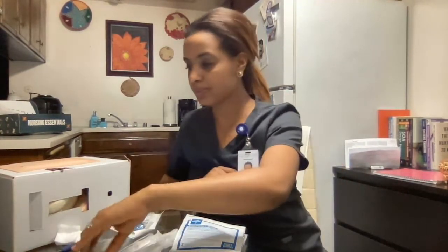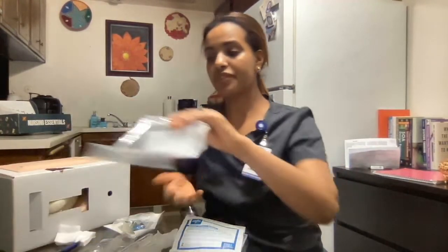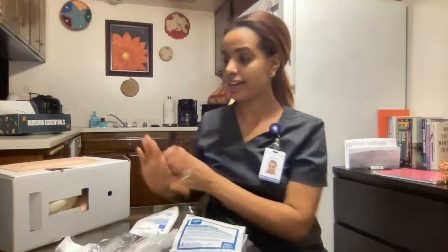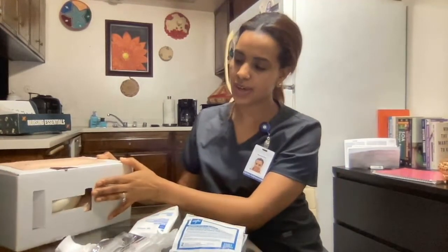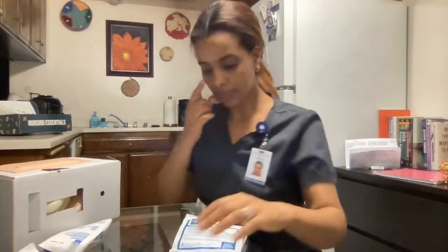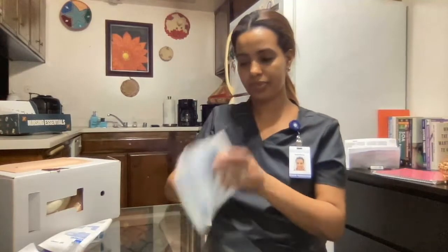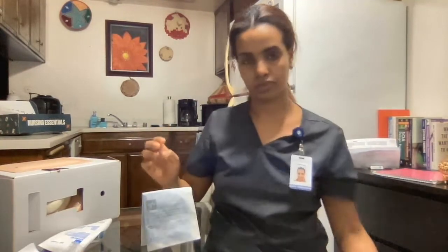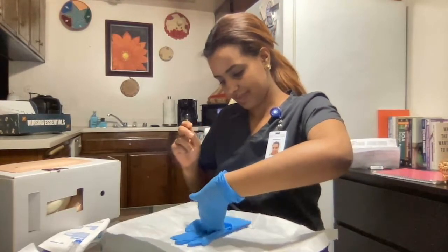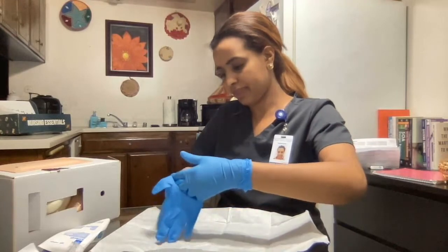For today's procedure I have my sterile gloves, clean gloves, and my 20-gauge peripheral catheter that will accommodate the prescribed therapy and the patient's needs. I also have my pre-filled flush syringe, IV tubing extension, extra gauze, my IV start kit, and my tourniquet.